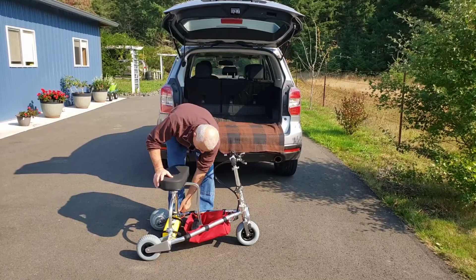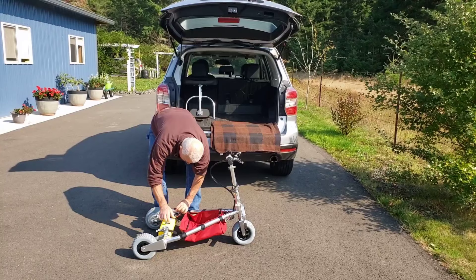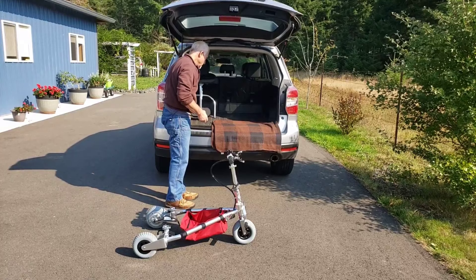We're going to lighten this thing up as much as possible by removing the seat assembly completely — that's 6 pounds — and removing the battery completely — that's 4 pounds. So you are now down to about 25 pounds total weight.